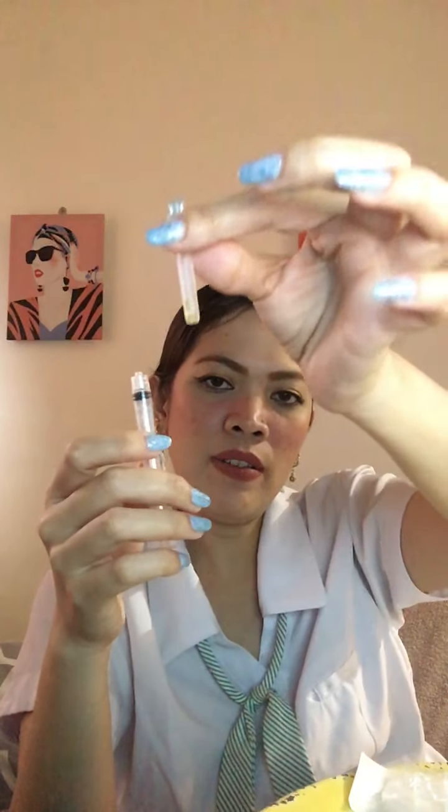You have to remove the needle from the syringe and dispose of the needle in the needle container and the syringe in its designated container to prevent accidental needle stick injury. Don't throw the syringe with the needle in one place. You have to separate them. Now document all relevant information. It's for legal purposes.